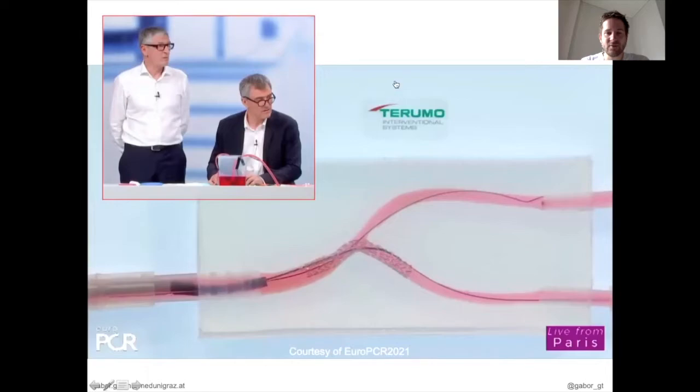I would like to invite you to follow this little clip where the yellow line shows the proximal stent edge at the beginning, while the red line shows the distal stent edge at the beginning, and the operators performed here really a perfect POT, large enough to achieve proper apposition, positioning the balloon nicely to the carina as suggested by the panel, as suggested by the commenters, and by this perfect POT, multiple POTs, at the end the case ends with a significant elongation, proximal elongation of a couple of millimeters.